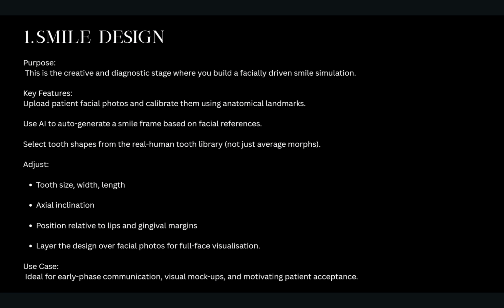Let's start with Smile Design. Its purpose is, it's the 2D component of the digital smile design. It's creative and diagnostic within the stage where you can build a facially driven simulation of the smile. Its key features are that you can upload a patient's facial photo and it calibrates using anatomical landmarks. It uses AI to generate a smile frame based on the facial references.